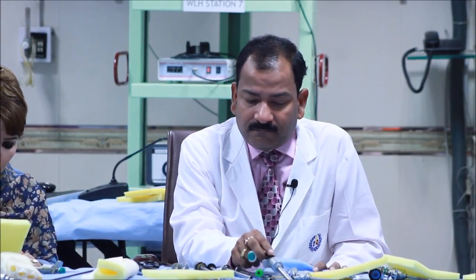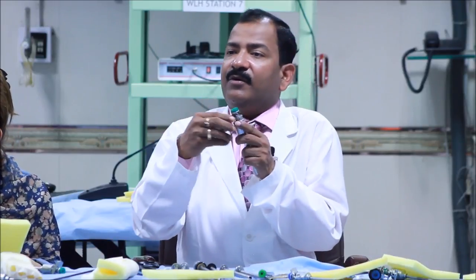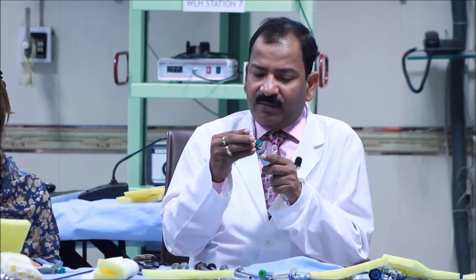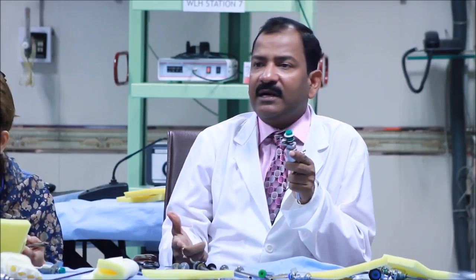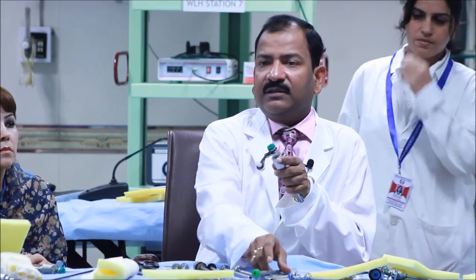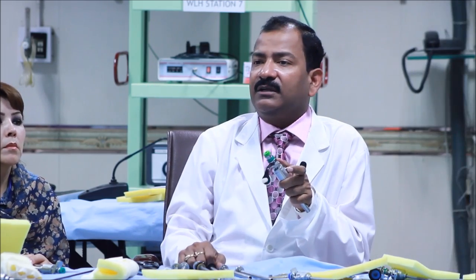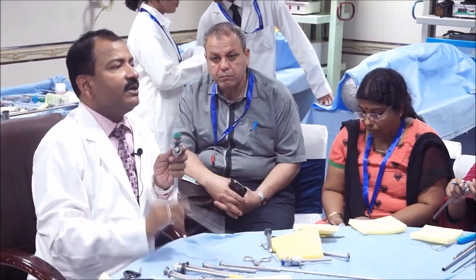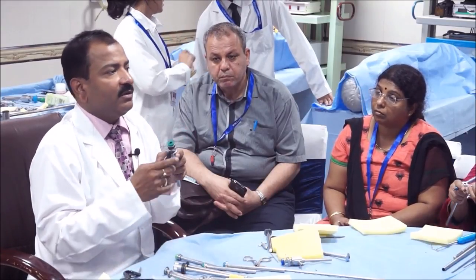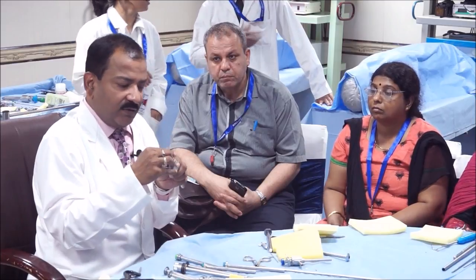Now, reducers are of two types. One is top mounted, so that if I want to make it 5 mm, I just put it on and it is done, 5 mm. Another type of reducer is the long reducer, which you can put in. Now, which one is good? Top loaded is good, okay, long is good, okay. Why?